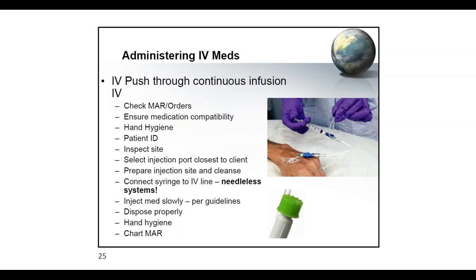So if in your drug handbook it says push it over a minute, then you need to push it over a minute. Make sure you're watching your watch, you're watching the time. And then same thing when you're flushing the medication, so make sure you flush before, you flush after, right? Flush after you gave that medication if there was no continuous infusion going. So flush after to make sure that everything goes in, and flush it at the same rate that you pushed it. After that, you can discard everything.